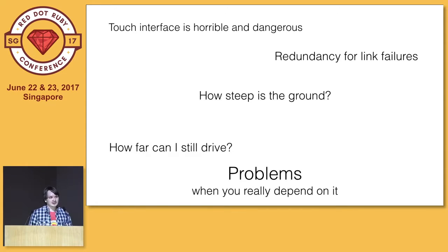For example, using a touch interface to control actuators is a pretty stupid idea. It's fairly imprecise, you have very bad feedback, and you can hardly get out of control. Then the wireless interface is sometimes unstable, so sometimes the wheelchair started to drive and I could not stop it. Another thing I didn't consider is that the way I controlled the DC motors worked by giving a constant power, and that depends on whether the ground is steep or not, or is falling down, so the wheelchair doesn't have a constant speed. It's an issue.